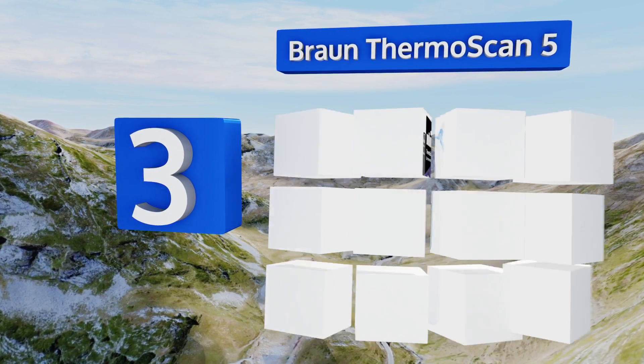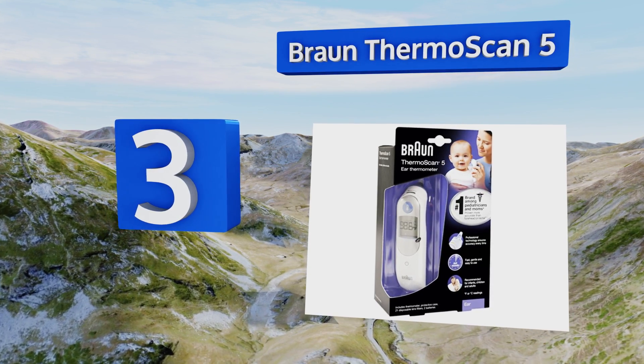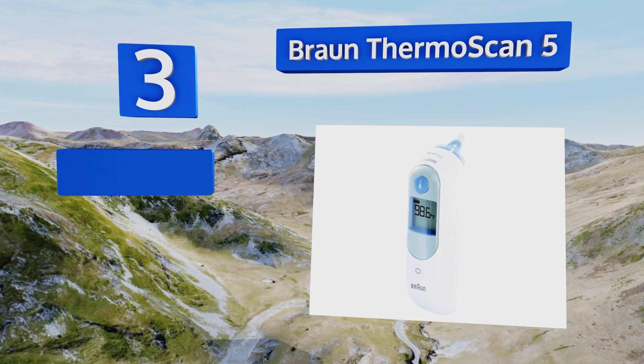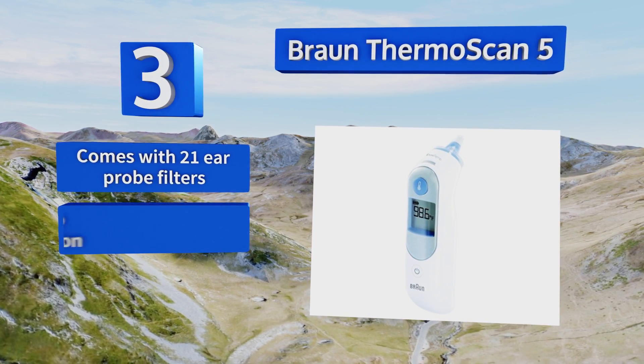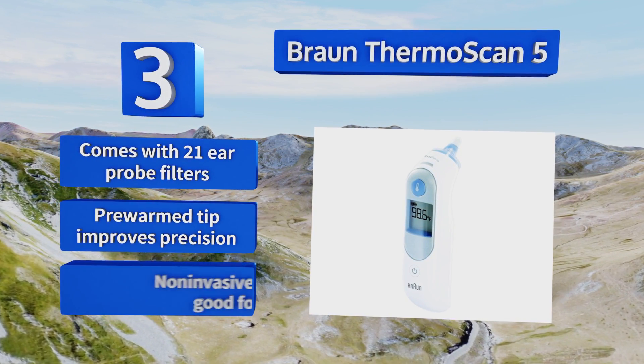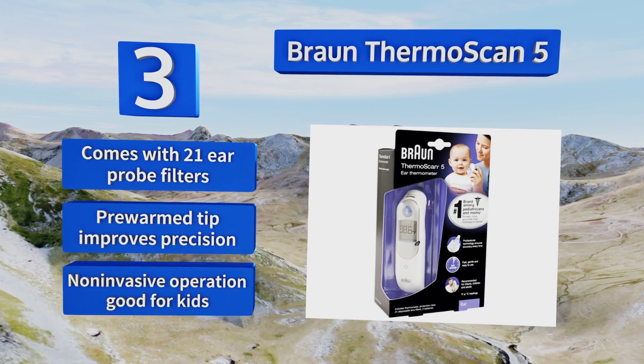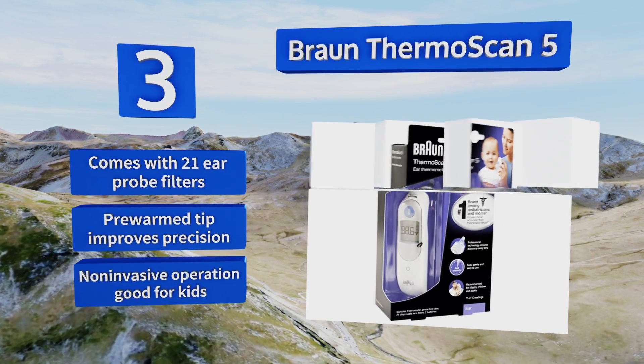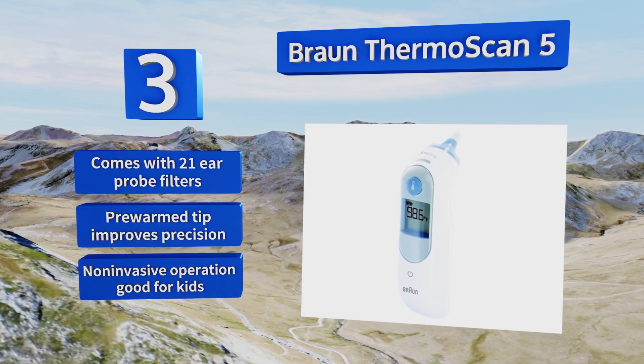Nearing the top of our list at number three, the Braun ThermoScan 5 is the most widely used infrared model among pediatricians, largely owing to its long lifespan and technical accuracy. There's nothing ornamental about this one — it simply does the job it promises to do and it does it well. It features a pre-warm tip that improves precision and a non-invasive operation that's good for kids. It comes with 21 ear probe filters.